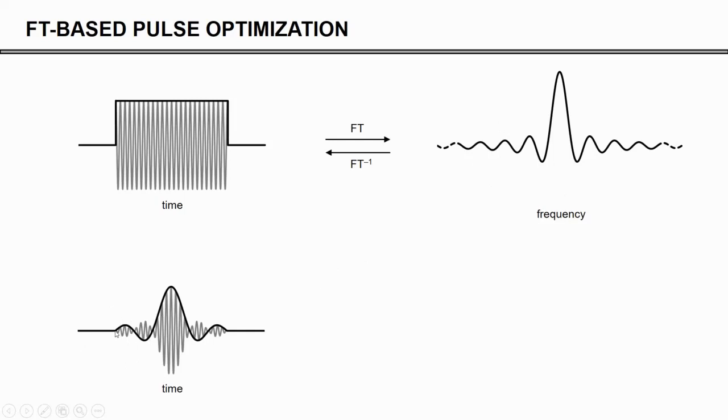Again, remember that the sinc only refers to the overall modulation, right? The pulse itself is still applied at the Larmor frequency. Now, this is now our truncated sinc function applied as an RF pulse in the time domain.